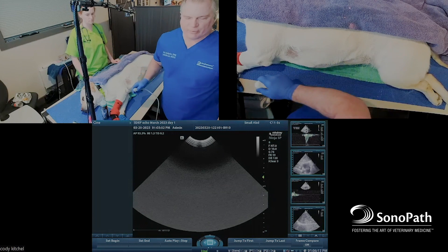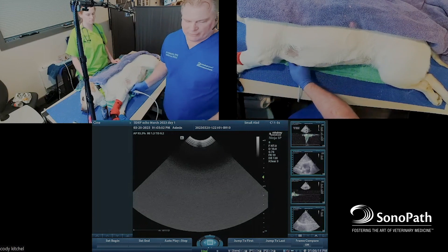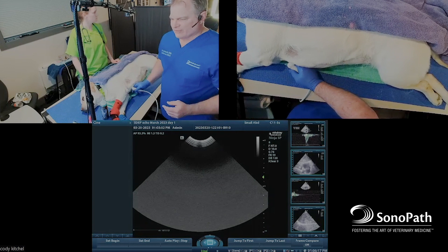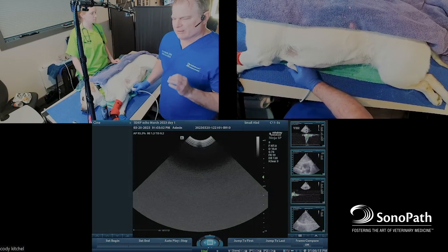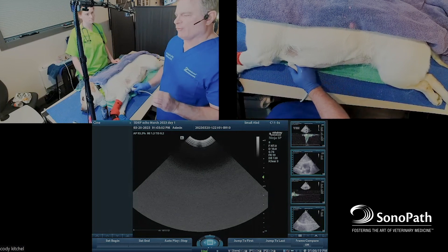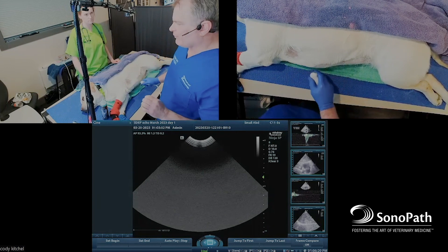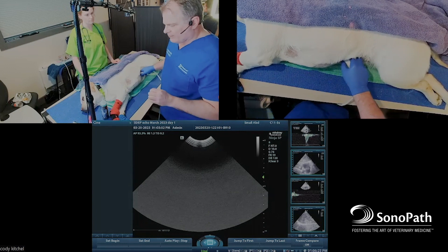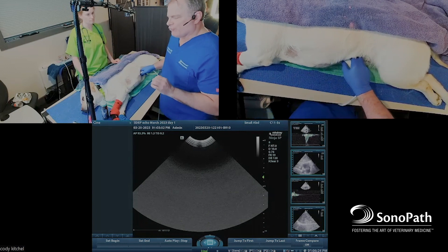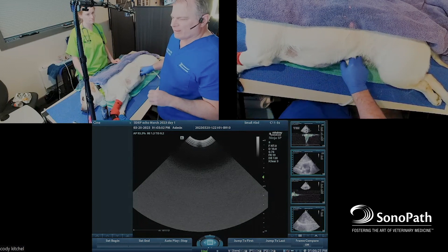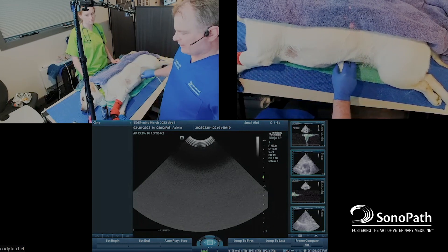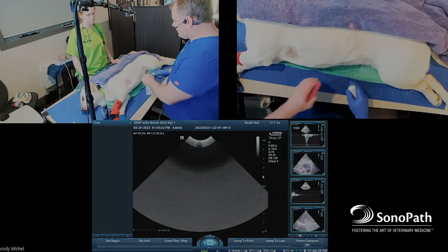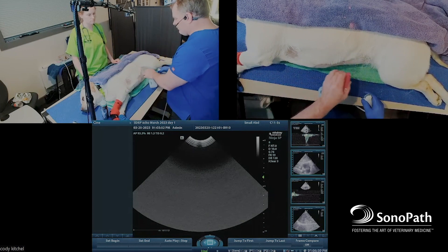This is especially important when doing echo Doppler — you need good power penetration, because Doppler is very sensitive to artifact, and you need a machine that can push through that artifact. Otherwise you're going to get sloppy Doppler, which doesn't look good and is non-diagnostic.